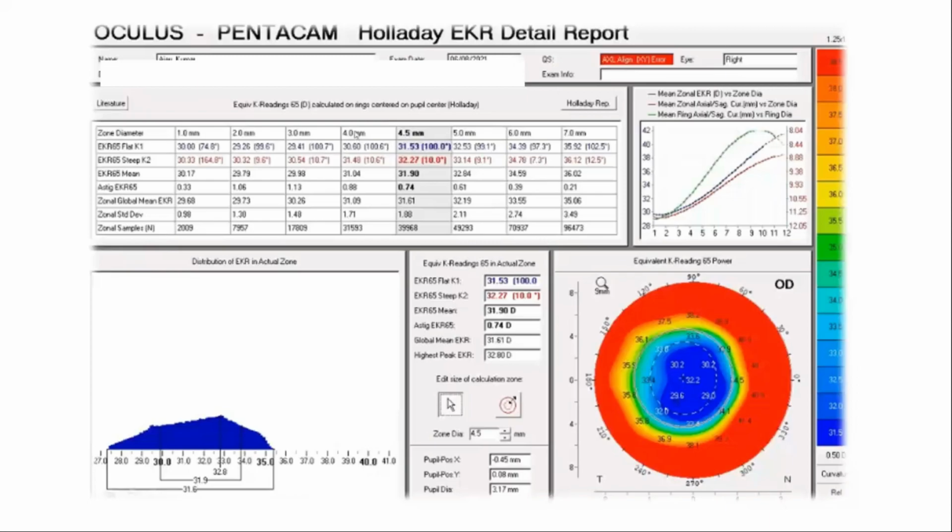AXL is an optical biometer, right? So obviously that would have more capability than the Pentacam. Pentacam AXL is basically Pentacam with optical biometry, right? Yes. So there it will include angle kappa and alpha, whereas just the Pentacam, which is for corneal applications, not for biometry, will probably not have that. AXL is not widely available yet, and it is still kind of beginning to roll out.